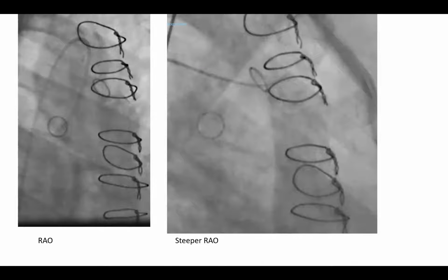Clockwise torque in general with a Judkins right 4 makes you point a little more anterior, and that's the case of those left grafts. In general, it's clockwise torque, although, again, it's not a definite rule. You may have to try in both directions. The key is to make your catheter point directly in that direction. So do whatever is necessary to point it in that direction.